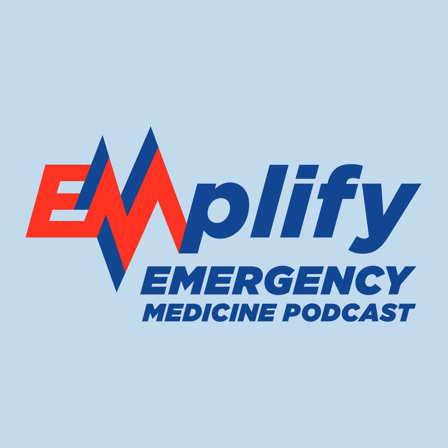Sure. So the critical thing when making your selections of ventilator settings, and we'll talk about when it might be preferable to modify those, but your standard ventilator settings are going to be based off of a number of milliliters per kilogram of predicted body weight, so not their actual body weight. So I'm 5'11, and people who are 5'11 have a lung size that is going to be very typical of people who are 5'11. If I gained 20 pounds or lost 20 pounds, the size of my lungs would not really vary. And so, if someone is morbidly obese or substantially underweight, using their actual measured body weight may lead to either underventilation or much more frequently over distension for our patients who tend to have larger body habitus.